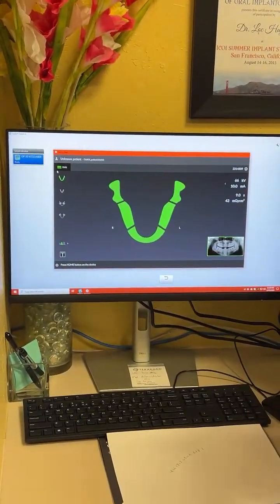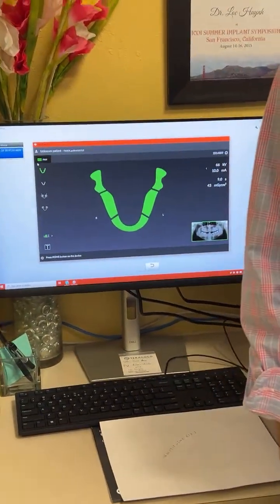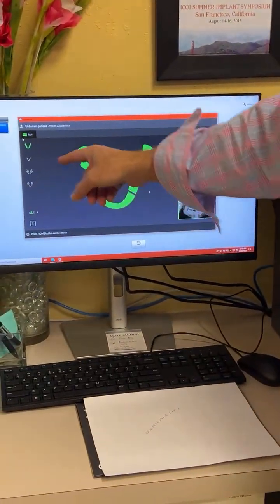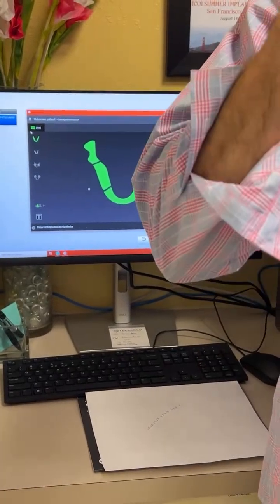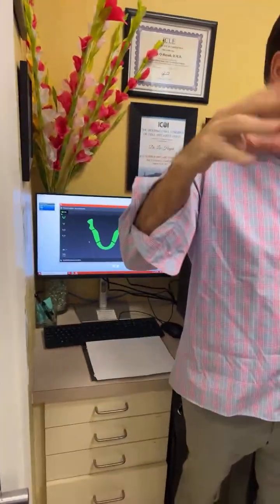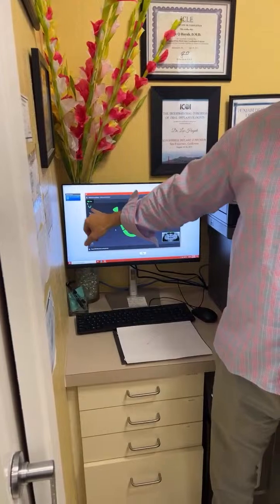Are you saying that for the 3D, we have to use directly from the software? Right. But the 2D we can somehow enter through EagleSoft just like this. Okay. So now we made that connection and that link through EagleSoft. We hit acquire from EagleSoft. And we had a template that said pano, and we hit new exam, acquire. And now it's going to the device. It's going to let you take a pano.